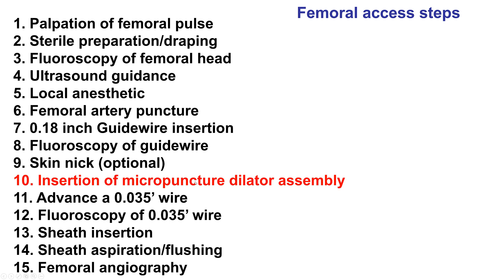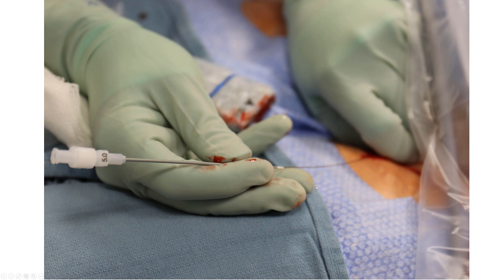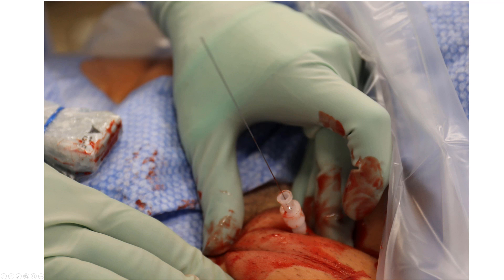We're at step number 10: getting the micropuncture dilator inside the vessel. This usually goes smoothly. However, even if it goes okay, it is important to perform fluoroscopy because sometimes, although the tip may seem to be on the skin, it is possible that there is some coiling or some kinking inside the subcutaneous tissue.